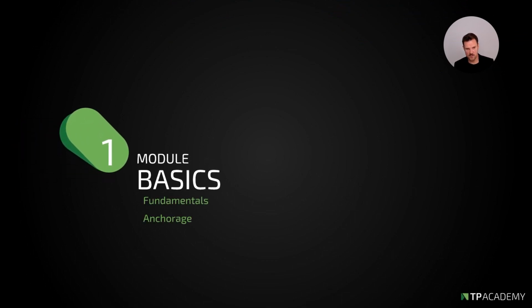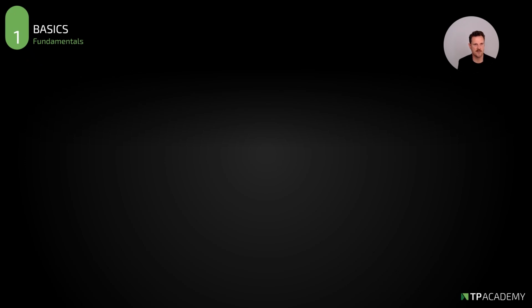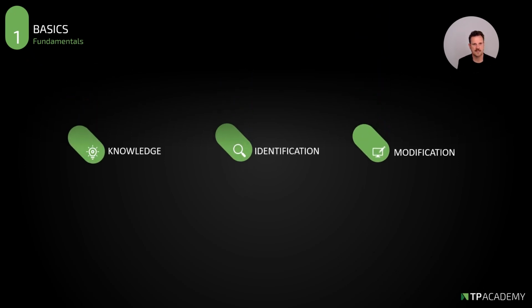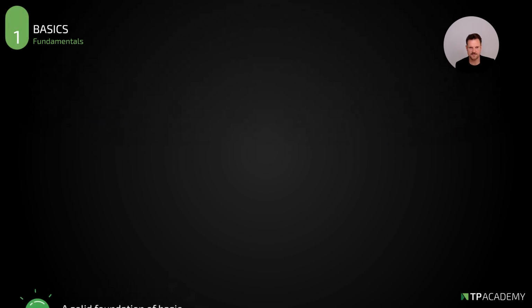So we start with module 1 with the fundamentals, and today we talk first about Anchorage. Knowledge, identification and modification. Everything needs to come together for you to end up with your perfect digital treatment plan. A solid foundation of basic knowledge is the key to success.